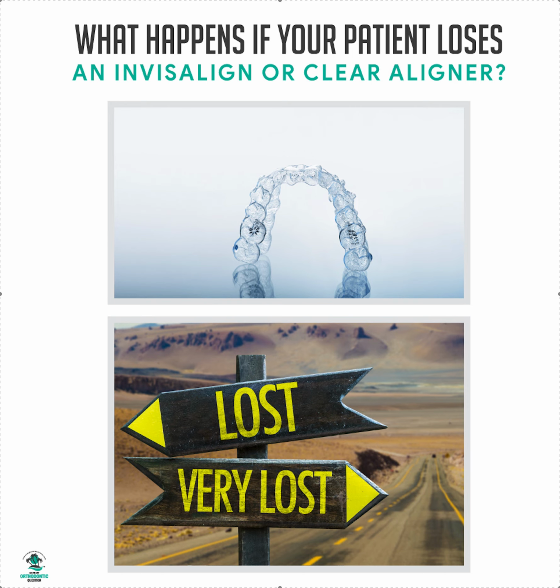So if they're not doing it, well, they're not following instructions, because that's important. There's a reason for that. So again, let's say patient loses aligner number, I don't know what aligner I said, now I'm going to say aligner number 20. What do you do? Well, did they bring in aligners, I don't know, 15 to 19 from their last visit, in between their last visit? Did they save them? Did they bring them in? Well, they should have brought them into the office. Okay, so try on 19 since you still have it. 19 upper and lower. Does it fit? Is it too tight? Does it seat? Okay. Maybe that's not so good.